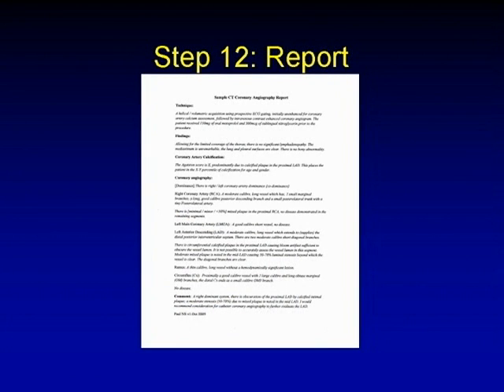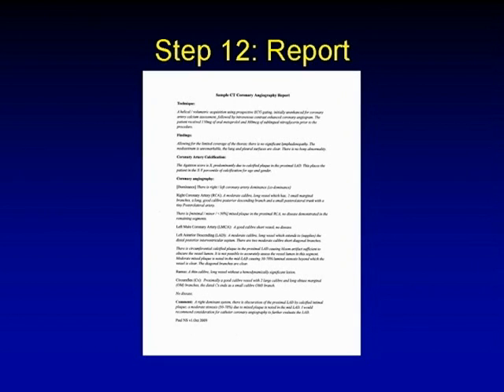And this is where it all happens, the report. Now, I know as cardiothoracic radiologists, we're a creative bunch, right? But we're not Shakespeare, and we don't need to be. And I would stress upon you that if we could have some sort of standardized reporting or some concise terminology, and a one-page report is usually all you really need. And I would put to you that ideally we should focus on something like this guy would say and really be very factual about it. And you could have some sort of creative prose at the end, because nobody's going to read through a 3-page scan. You know what your colleagues will do.